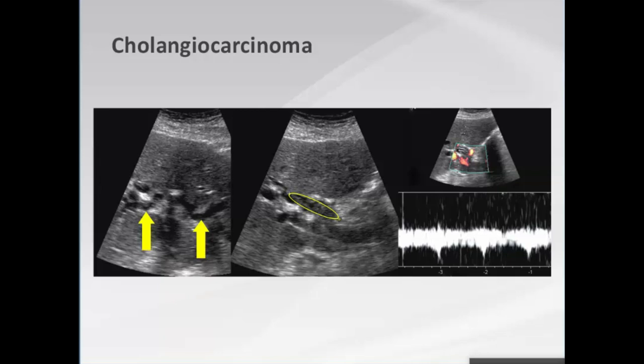Looking for new biliary dilation — seen here intrahepatically in both lobes — you must follow the ducts centrally to determine if they communicate. At the level of the common duct, polypoid papillary excrescences were seen within the lumen: is that sludge or tumor? Doppler and contrast ultrasound are very helpful here. Even with spectral Doppler, don't rely just on color — you need a spectral tracing. Arterial flow was demonstrated, and this was a polypoid cholangiocarcinoma.